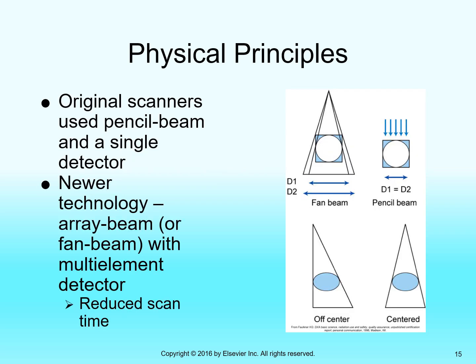So originally we used a pencil beam and a single detector. Newer technology does use a fan beam with a multi-element detector. So it's very much like a CT scout image in the newer ones.